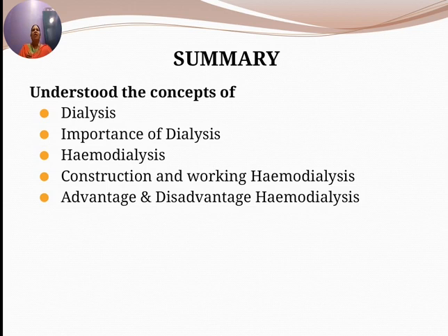So the advantages and disadvantages of hemodialysis: the advantage is that hemodialysis is an effective treatment for those with end-stage renal disease. However, hemodialysis alone will not provide a complete treatment for those with kidney failure.